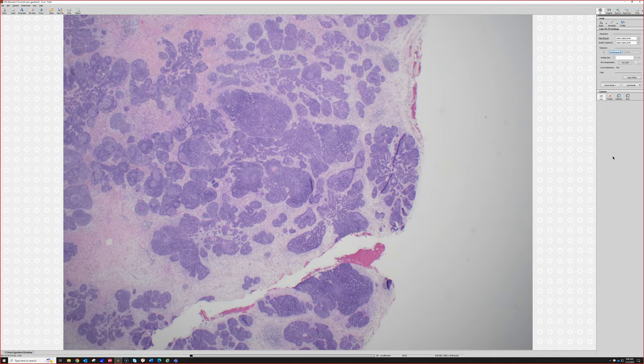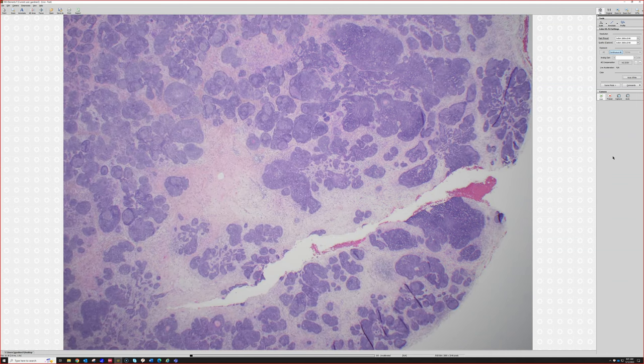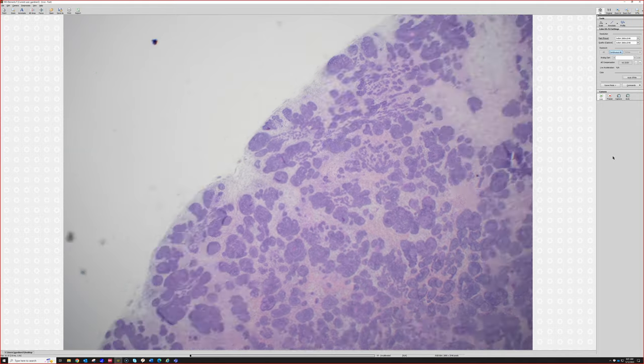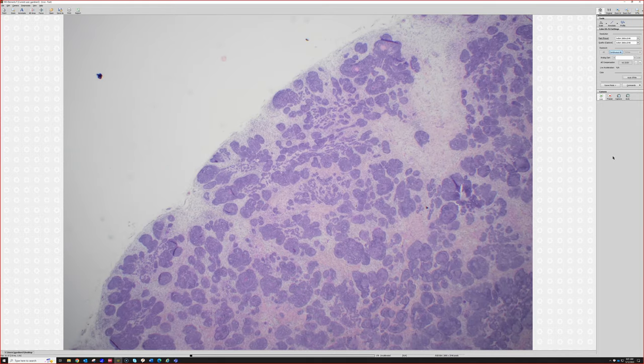So one thing that helps me, blue basaloid with this branchy kind of staghorn antler shape look, that always makes me think of hair follicle, although we know basal cells can do that too. But look what we got here. We've got a nodule that's popped out basically with nothing attached to it. So probably it was deep dermis or subcutis, right?